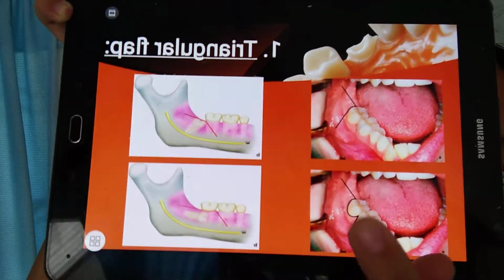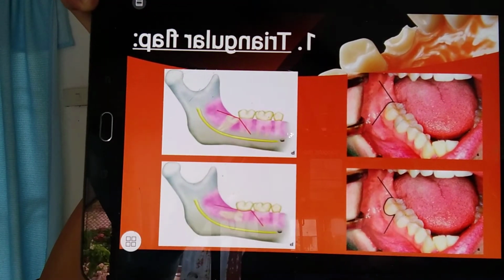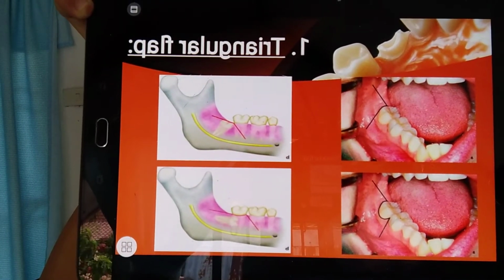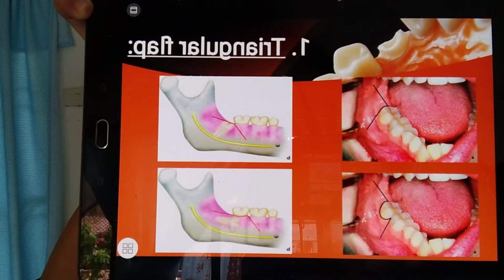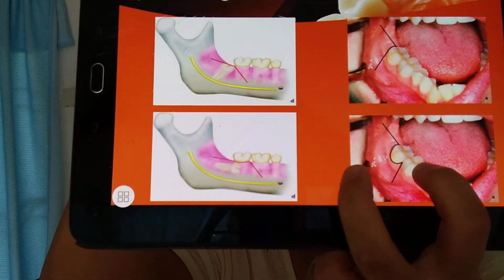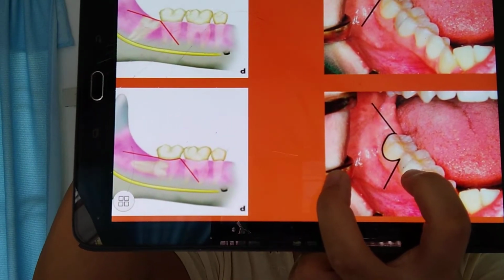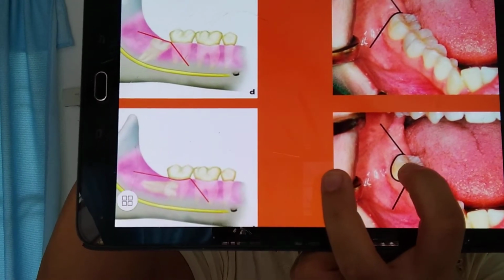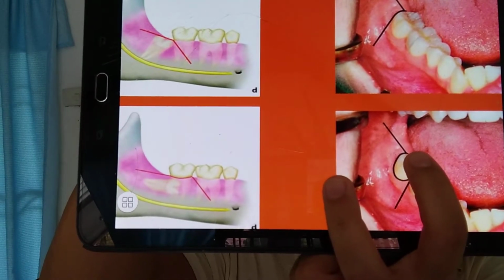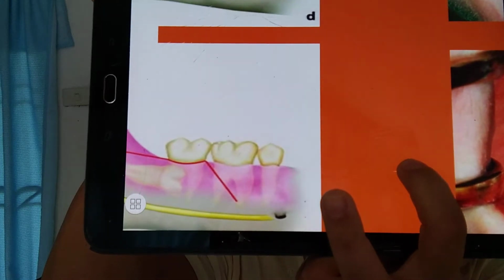But in cases when impaction is deep, to ensure a satisfactory surgical field, or the impacted tooth conceals the roots of the second molar, the incision may continue along the cervical line of the last tooth, while the vertical incision begins at the distal aspect of the first molar.